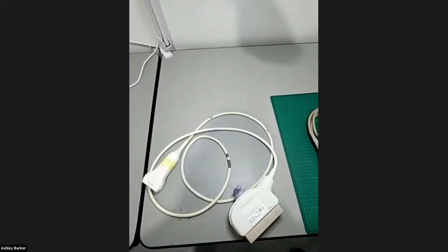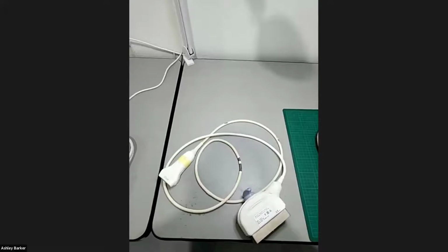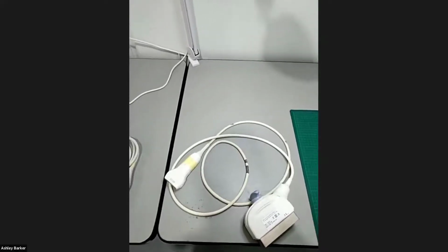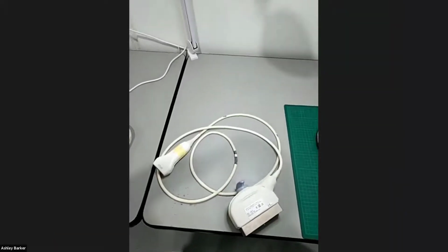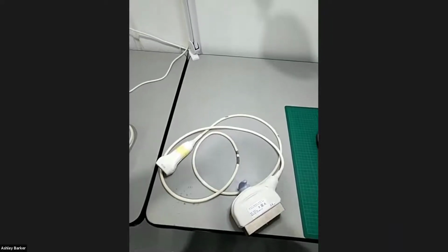They've got more streamlined ones now, but it depends on how many modes you have running. Chews the battery, like all of the probes. The more things you make it do at once, the more energy it uses. The other thing as well, a lot of the new wireless probes are coming out with silicon chip-based crystals on them instead of the old piezos, and they draw a lot less power. So that's how they're getting the battery life right up with a lot of those.